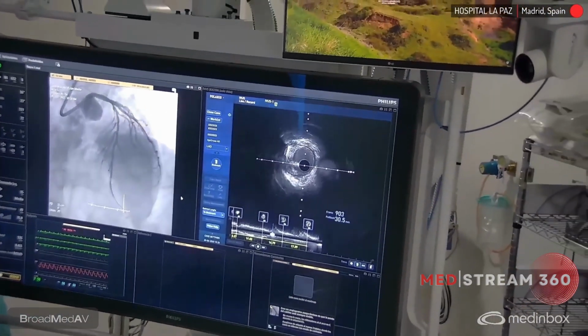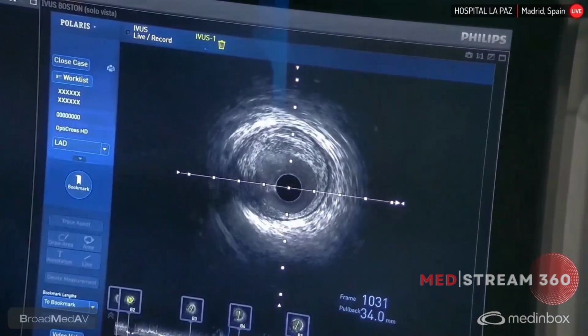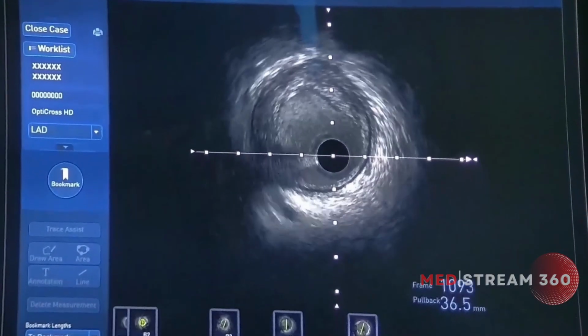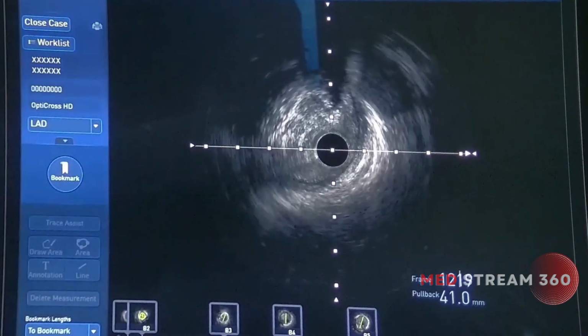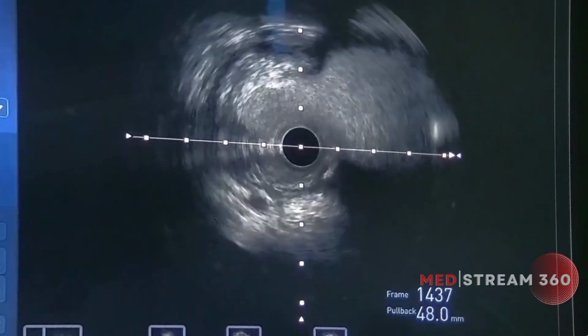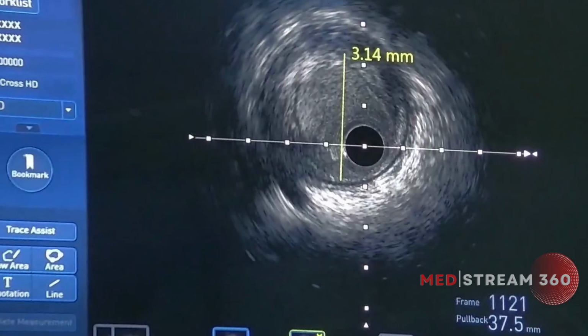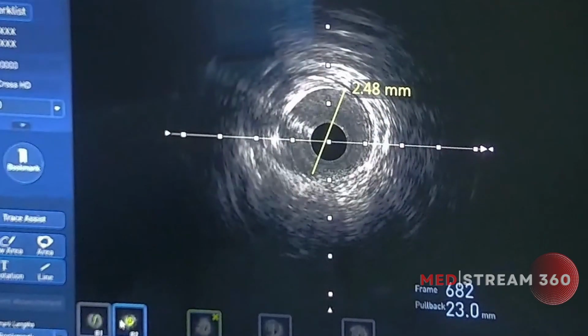This is the diagonal, the second diagonal, rising. This is the proximal mid-LAD. Proximal LAD is 3.25, 3.5. This is the ostial LAD, and you're going to see the circ. This is the circ with the wire, and this is the left main. This is the proximal LAD, 3 point something, 3.5 probably. The next one, Borja. Mid-LAD, and distal to this point probably is 2.5, all the vessel.